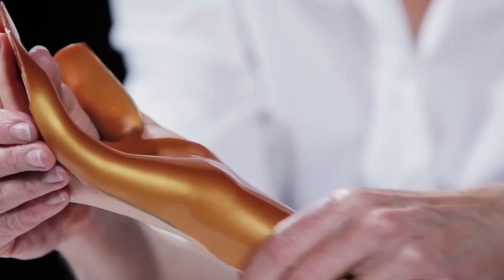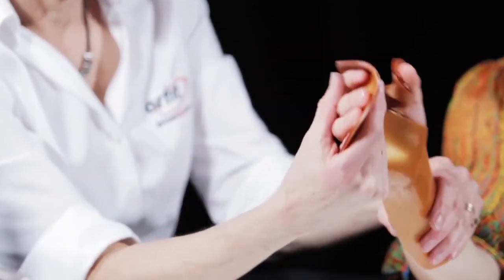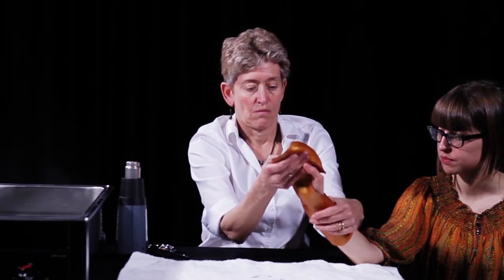Do not pinch tightly in any one spot to avoid fingerprints and pressure points. Flip the patient's hand into pronation to check the alignment on the dorsal side. Let the material harden in the desired position.